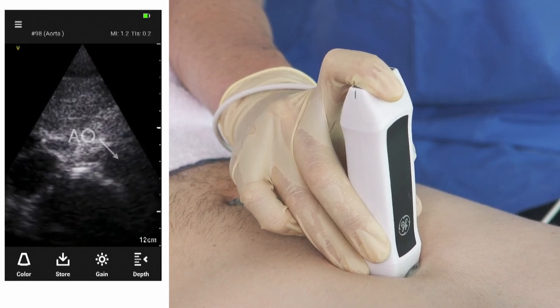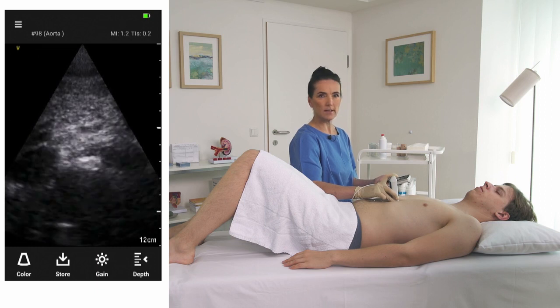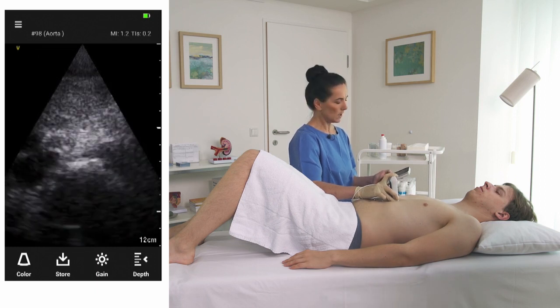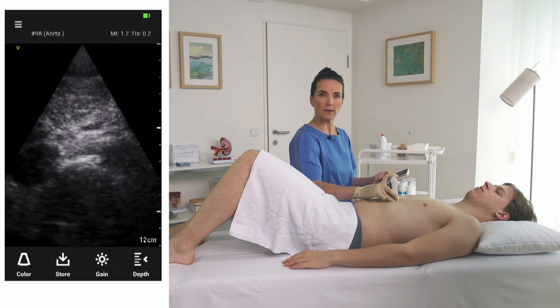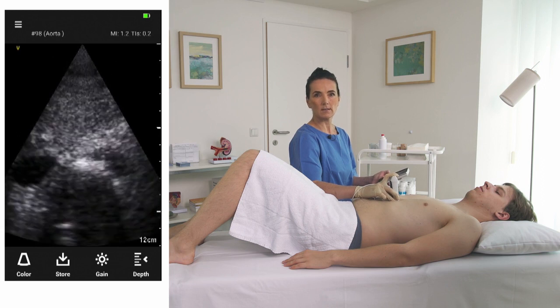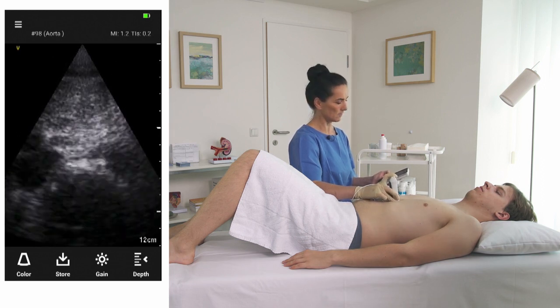The center of the screen is the spine. You can clearly differentiate the IVC from the abdominal aorta by looking at the respiratory changes with the breathing of this patient. On the right-hand side, you can clearly see a strong pulsating structure.